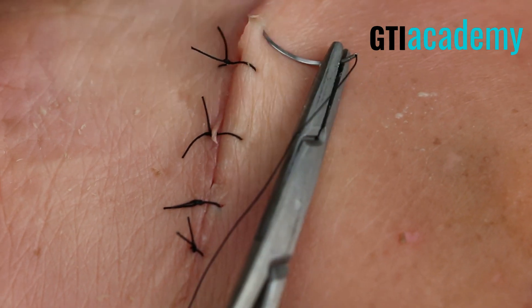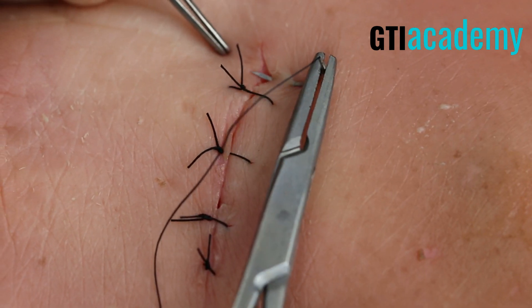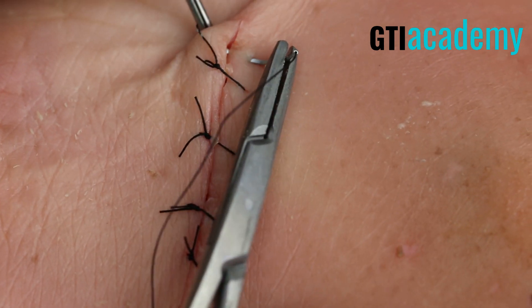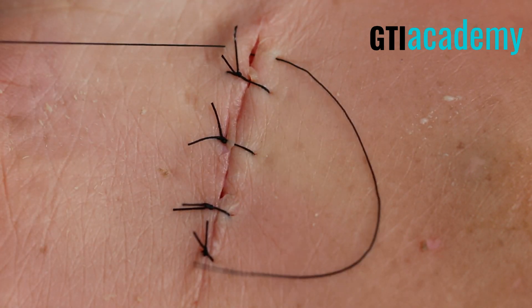There's the very top — let's throw one more right here. Notice I'm driving that needle into the subcutaneous tissue. Don't be too superficial; the suture will not hold.